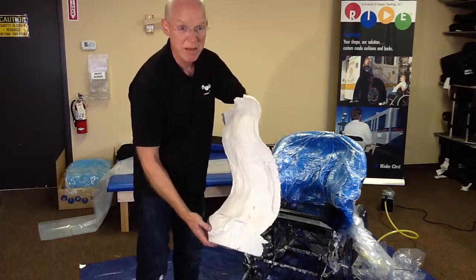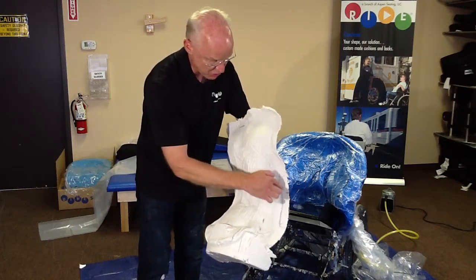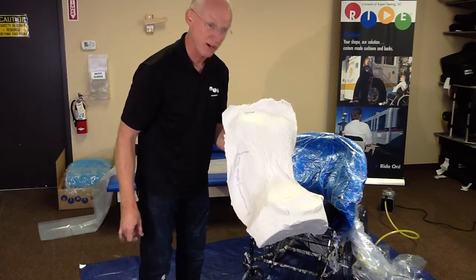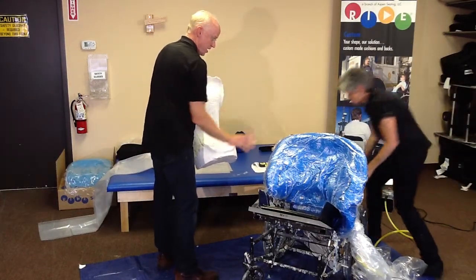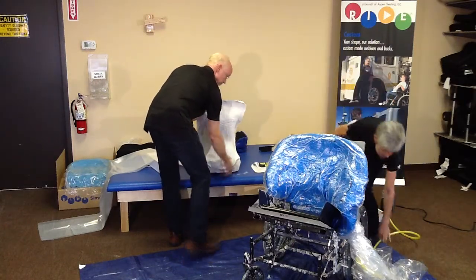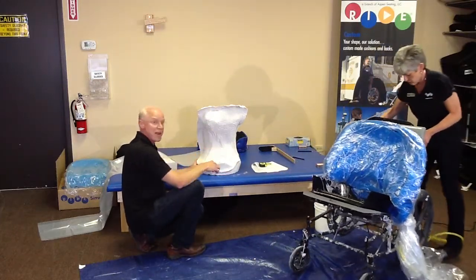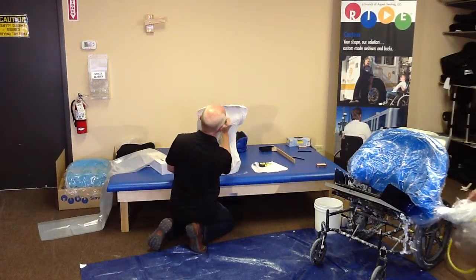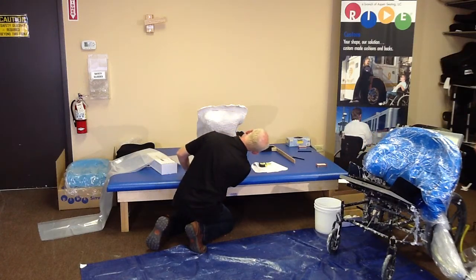And this is Jenn's shape. I'm hoping you'll be able to see how those black Sharpie marks have transferred onto the plaster. You can see the reference lines for the abdominal panel. Now what I'm going to do, Claire, if you don't mind backing the simulation off just a couple feet there maybe. I can let the shape balance on a level surface, and I'm going to just connect the dots, and then we'll draw my back support. Find my trim lines.